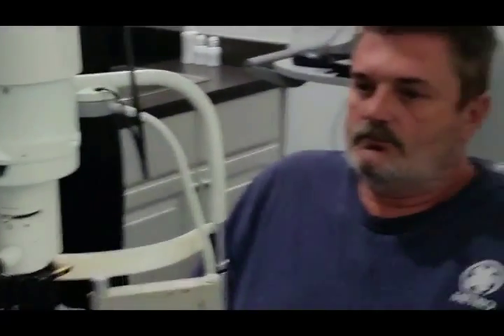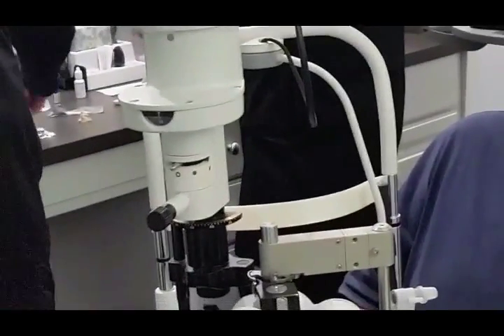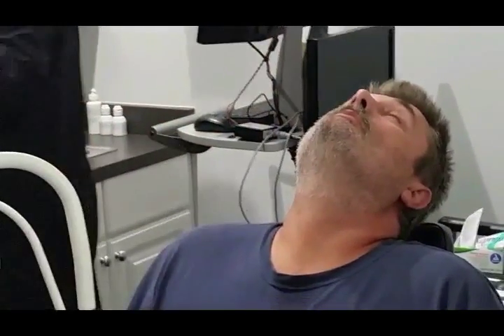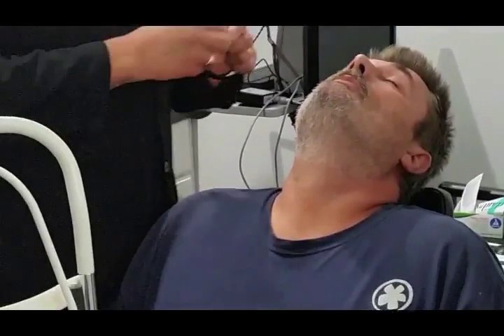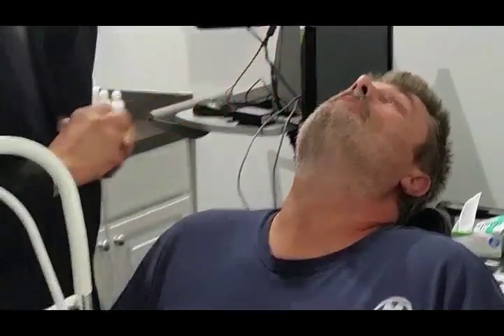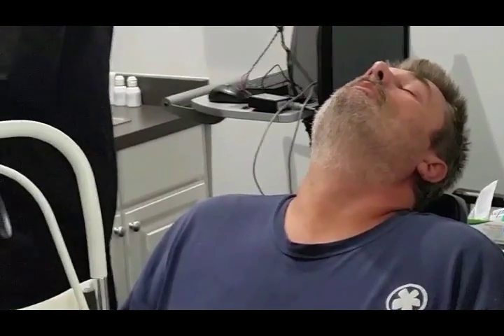Before we apply the graft, we're going to instill a drop of combination antibiotic anti-inflammatory. In this case we're using Zylet and then a drop of diclofenac. Many of our patients who have this procedure will also elect to cycloplegic the eye, and that's what we're doing here as well.